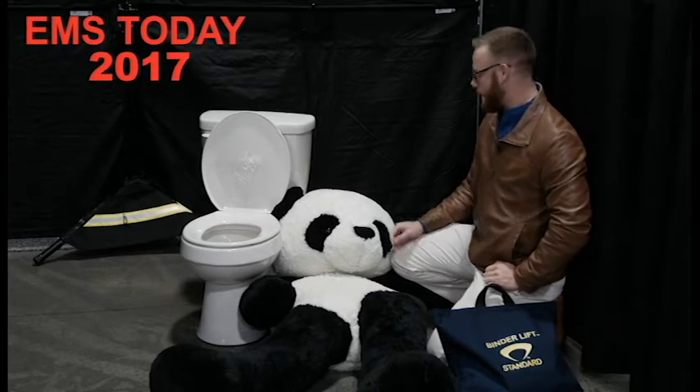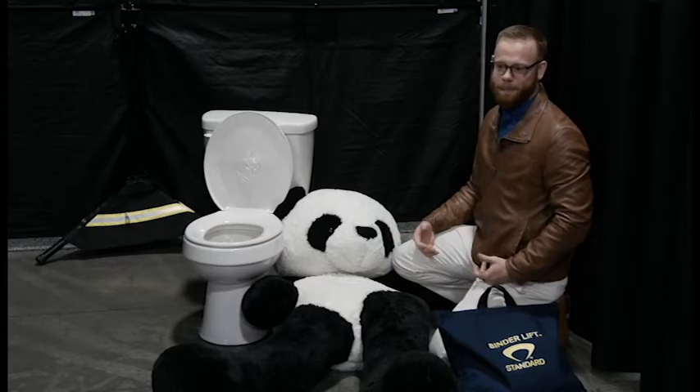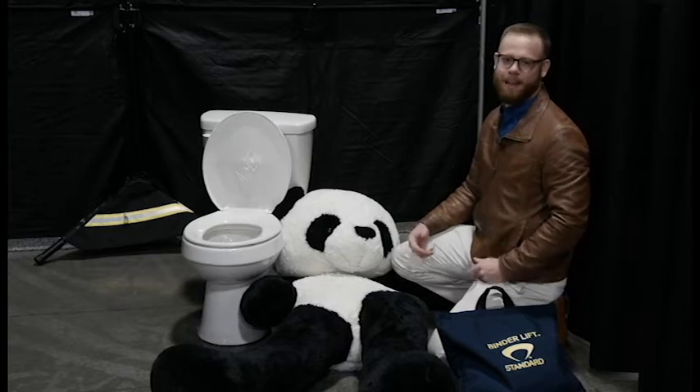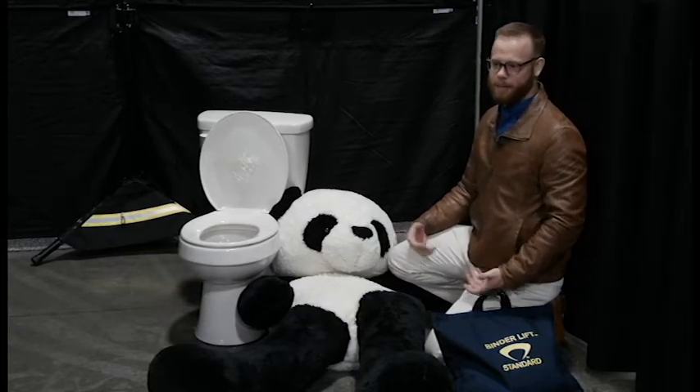Hi, my name is Rick Bender and I'm here with my friend Panda, who slipped in the bathroom and can't get back up. Chances are if you've been in EMS or fire for very long, you've been in the same situation where you've had a bariatric or geriatric patient who has slipped and fallen and needs help getting back up.